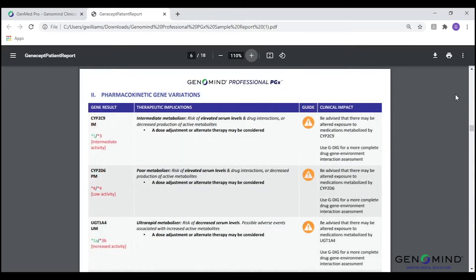The second part of the gene variations pages focuses on our pharmacokinetic genes. The Genomind Professional PGX Express report highlights nine pharmacokinetic genes associated with drug metabolism, absorption, or penetration. Variants in these genes may lead to alterations in blood or brain levels of medications, also denoted on our report as drug exposure.